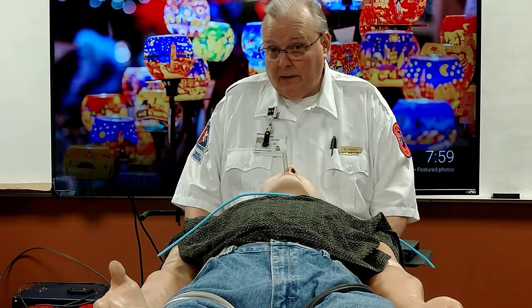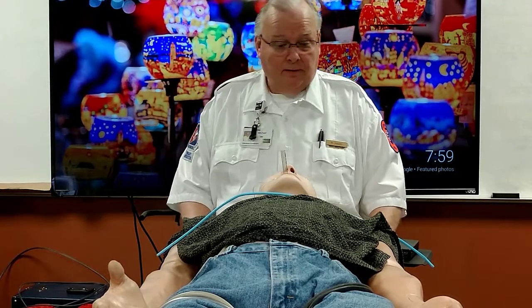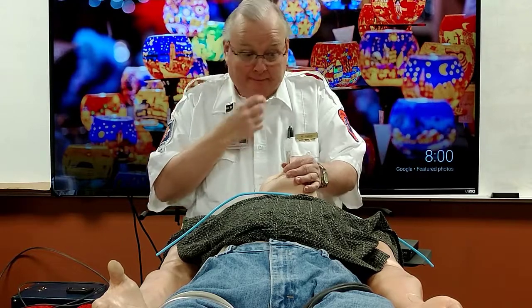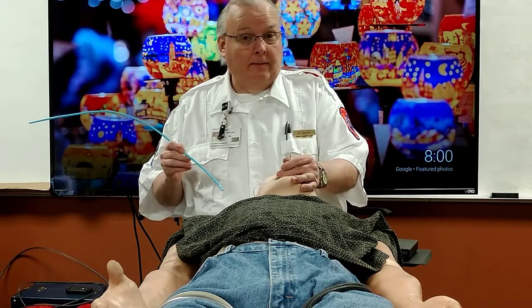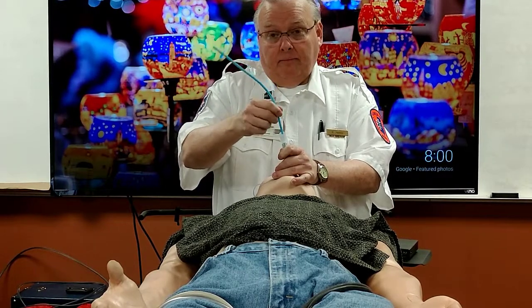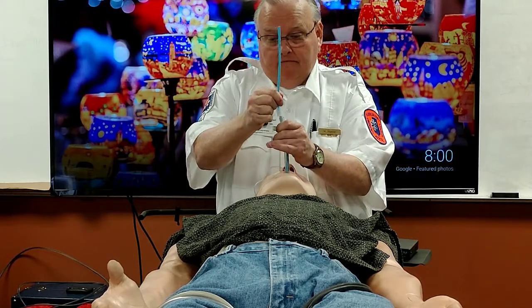So another function of the bougie can be to change endotracheal tubes if you need to. We don't often have to do that very much, but it's possible that you may have to. So as you have an endotracheal tube here, maybe the cuff has deflated, the cuff has been cut, the airline has been cut, it's important that once you unsecure the tube from the securing device, you hold on to it. You can put your bougie down in there, and then slowly holding the bougie, slowly withdraw your endotracheal tube.